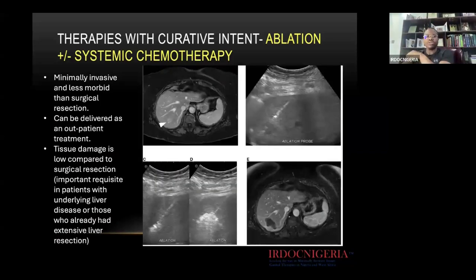with microwave ablation. So the nice thing about microwave ablation is it's a minimally invasive procedure. You could pretty much do this with just a little bit of local numbing medicine and a little bit of sedation, and it can be delivered as an outpatient treatment. So this is one such procedure.